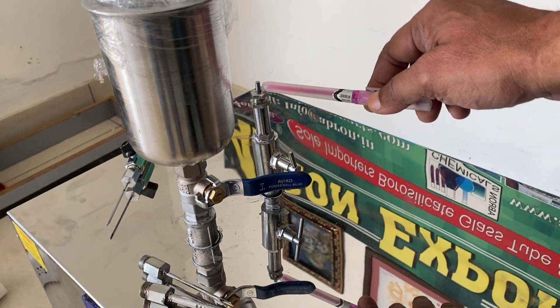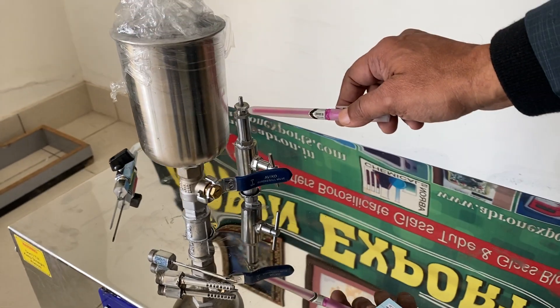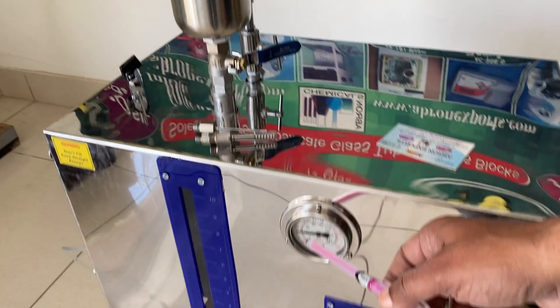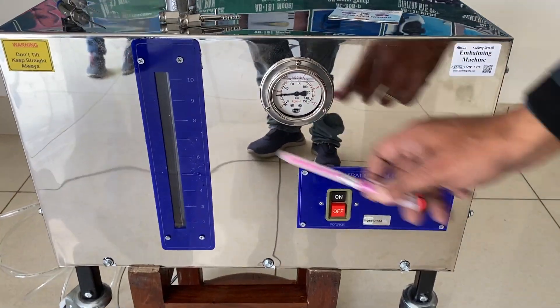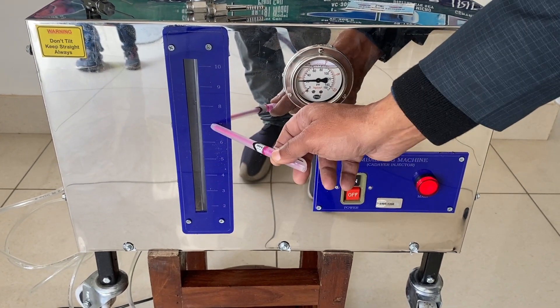It automatically stops the machine when there is huge pressure. But if there is even more pressure, there is a gauge which tells you the pressure. You can see now the pressure is increasing — it is up to 40. You have to put the formalin, say about 5 or 7, not more than that.